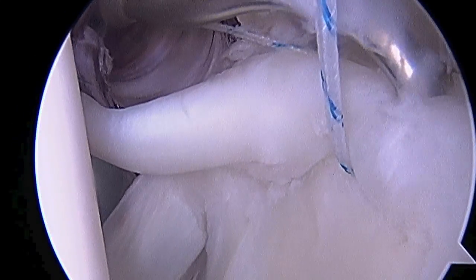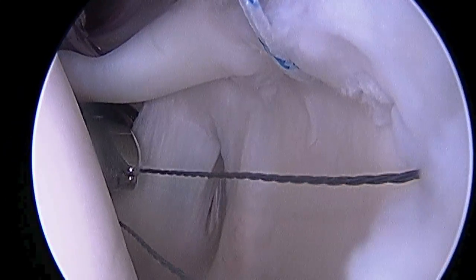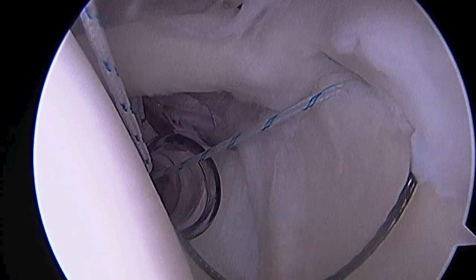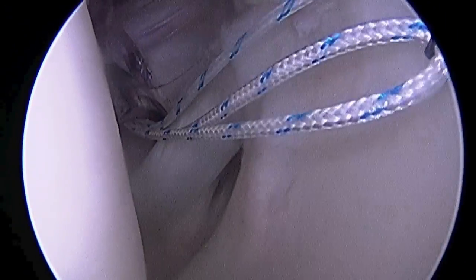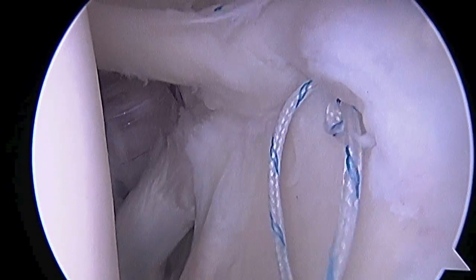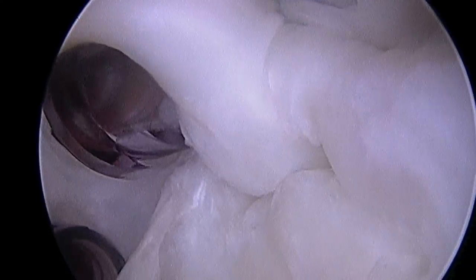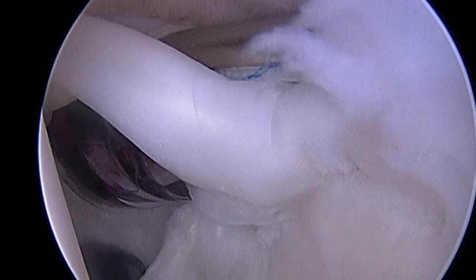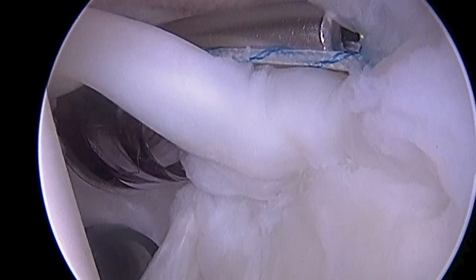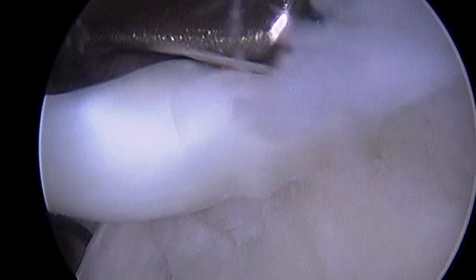Let's look at that one more time. There's the curved suture passer going into place. I pick the spot where I want the suture to be ultimately. Pass the passing cable — you can see how it has a loop there at the end. We'll then retrieve the last stitch of this repair, place it in the loop of the cable suture passer, and pass it through the tissue. In this case you'll be able to see the knot pusher a little bit better. There you see me sliding my knot down to the level of bone and compressing the superior labral tissue down to bone. Then I'll throw four or five throws to secure the knot. Then here you see a knot cutter coming into place.